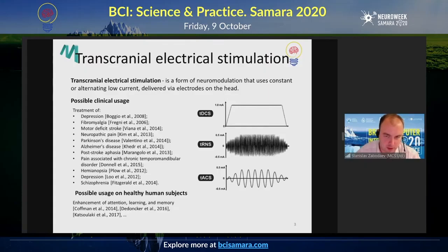In most cases, they of course use DC stimulation. That's a historical thing. DC stimulators are quite affordable and available, and it can be explained in terms of neurophysiology, and anything else is something exotic.